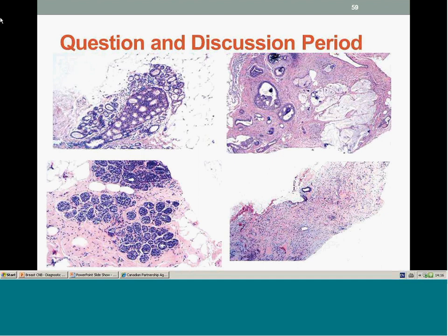Next question has to do with biomarker testing biopsies. In a multi-site institution, specimens from some sites do not meet cold ischemic time requirements. Would you recommend doing biomarker testing on those cores? Probably yes. As I said, the trend, starting with the ASCO-CAP guidelines, really is to do it on the cores. And for various reasons, some of us don't.